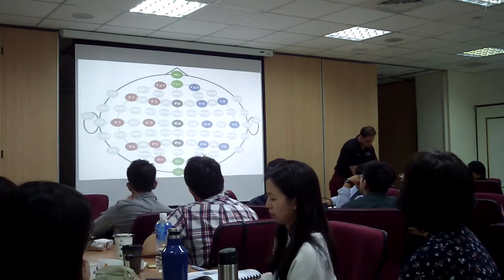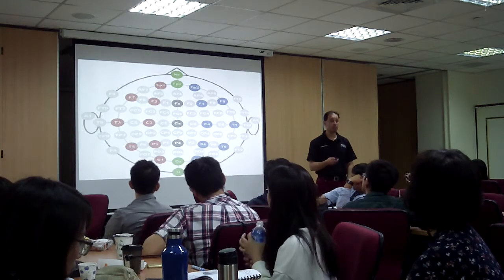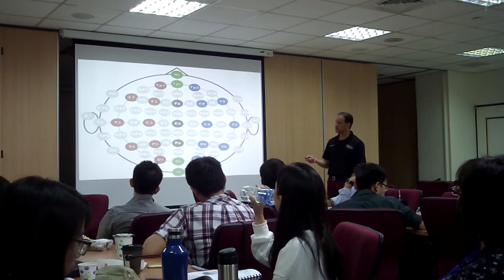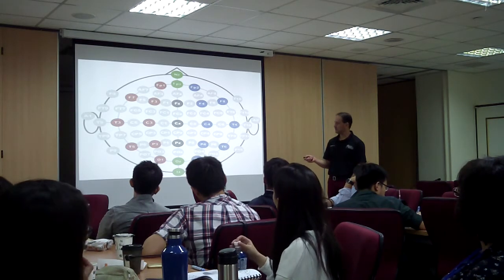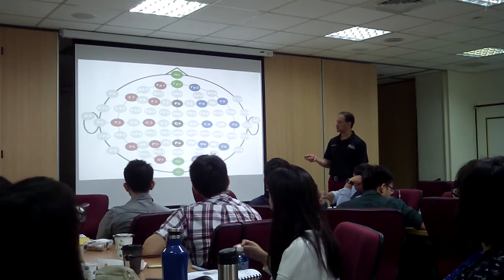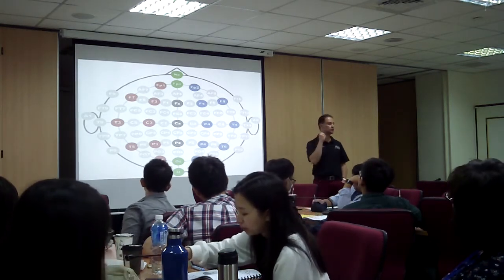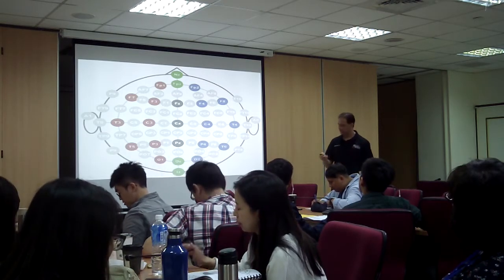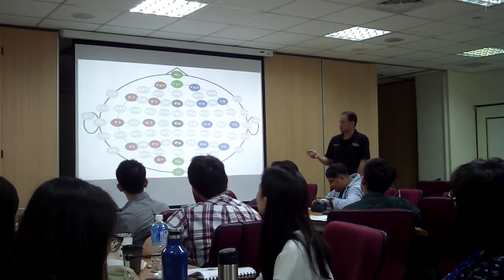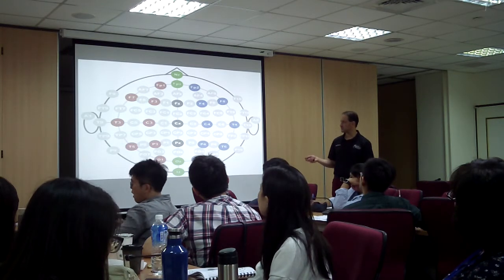So when you talk to your mentor or talk to a colleague and they're describing a protocol, you're going to use a CZ to T3 montage with linked ears, and you're going to uptrain 12 to 15, and you're going to suppress 2 to 10. That's the language we speak in neurofeedback. So they're not going to tell you need to suppress alpha, theta. They're going to talk about the frequencies, and they're going to talk about the brain sites. And the way you learn them is by just repeating them. The more neurofeedback you do, the easier it is for you to remember this.